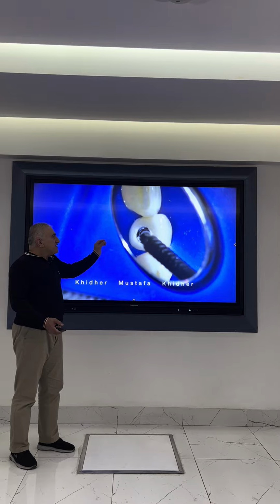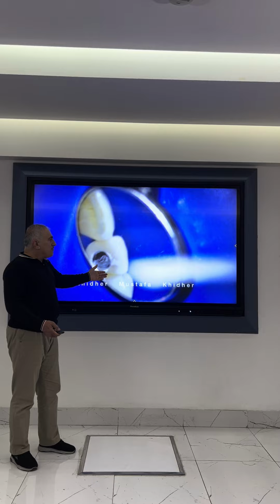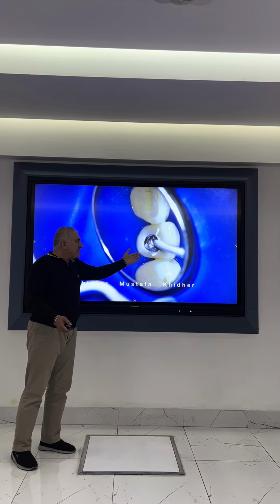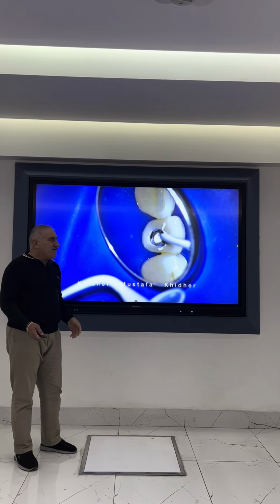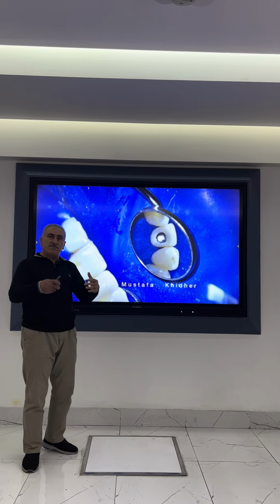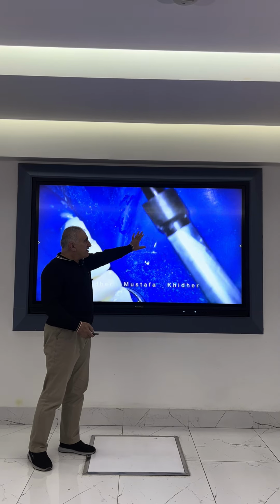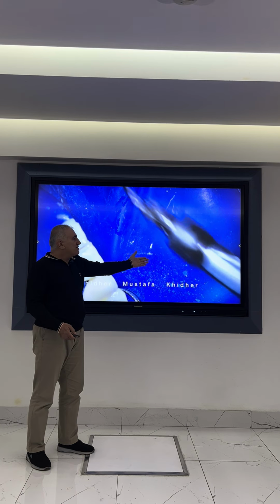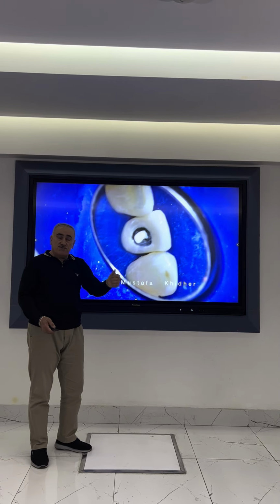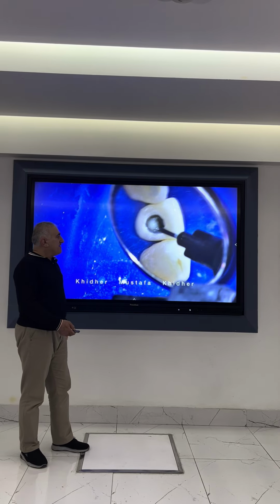After these two very small layers, I use a flowable or traditional bioceramic, putting again a small amount inside, then another layer of putty bioceramic. Why? Because I want to make a hermetic seal, with intimate contact of the bioceramic with the walls. So this is the final layer. I should protect this layer with light-cure MTA liner. And the marker is going over the tube, because after every case we should put alcohol to disinfect these tubes, so the writing is going over the tube.